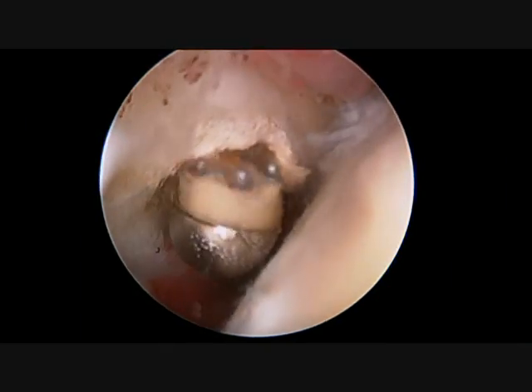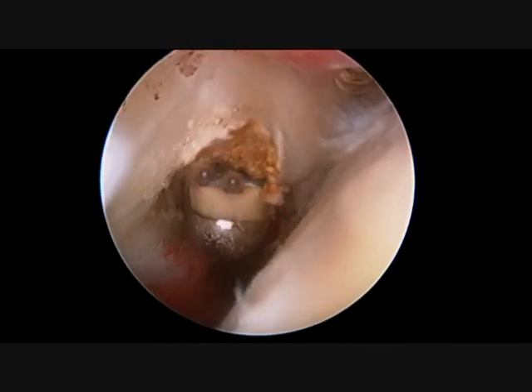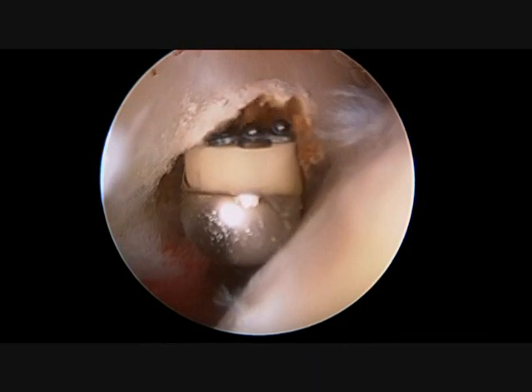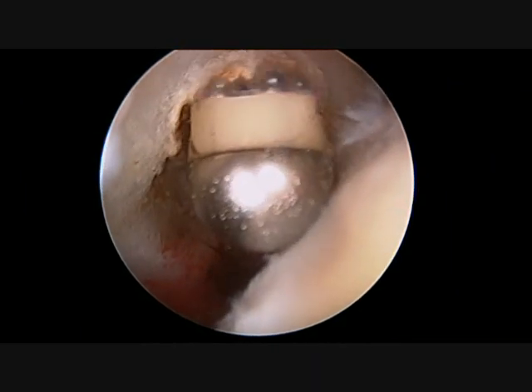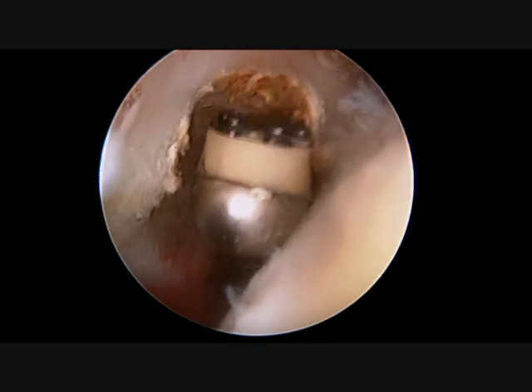A vaporizing wand, which both cuts and vaporizes the tissue, is used. The biceps tendon is fairly thick and can take a little time to be cut. The biceps is under a significant amount of tension because of the pull of the biceps muscle, so when the last cut is made, it will quickly slide out of the shoulder joint.